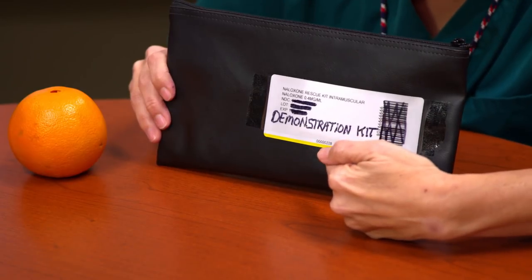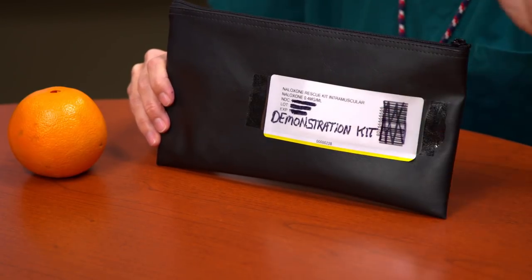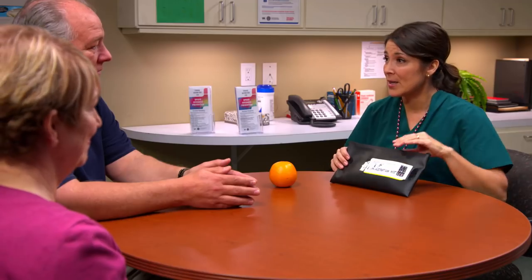But we do like to spend a few minutes making sure our patients know what they'll find when they open this kit for the first time. I mean, if you ever actually need the kit, you're not going to have a lot of time on your hands. I appreciate it. Here we have our sample kit to play with, and it's got DEMO in giant letters right here to make sure we know that there's no actual medication in the kit. So it's safe to use for times just like this.